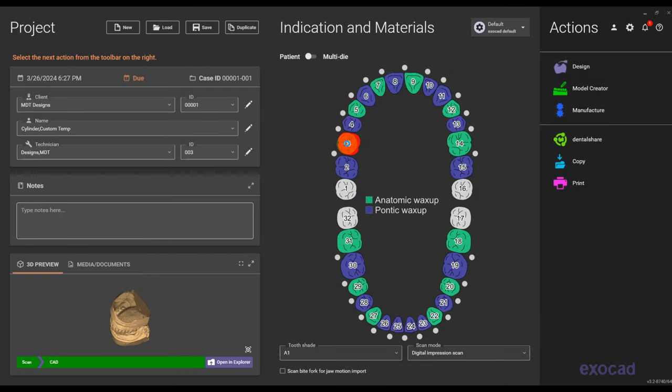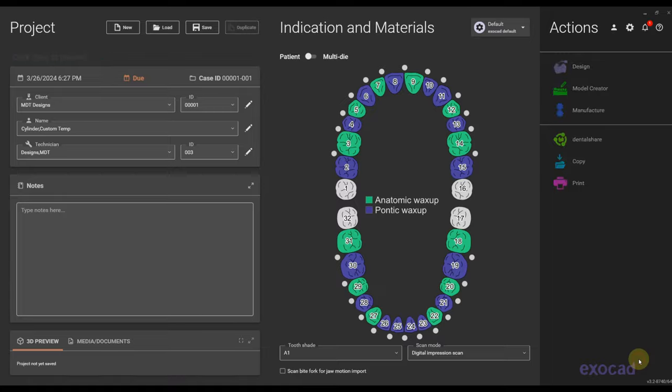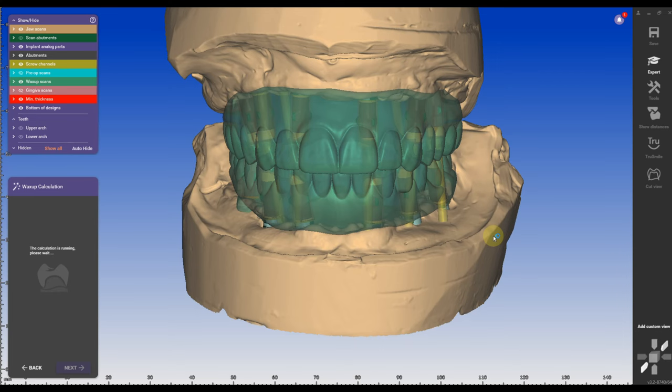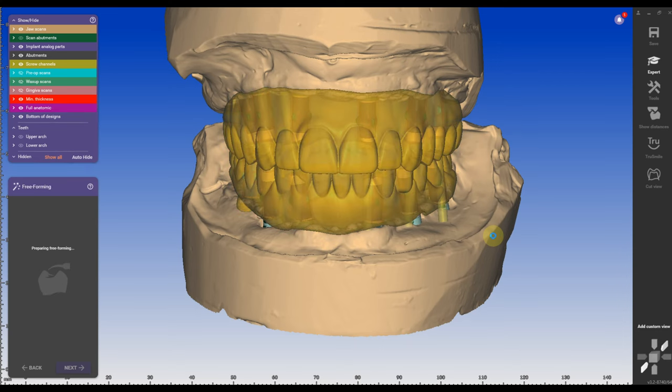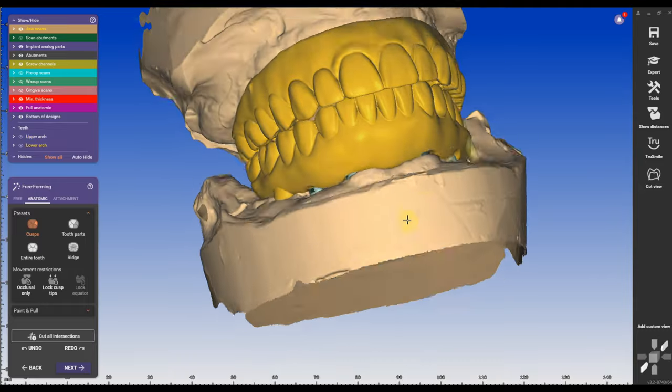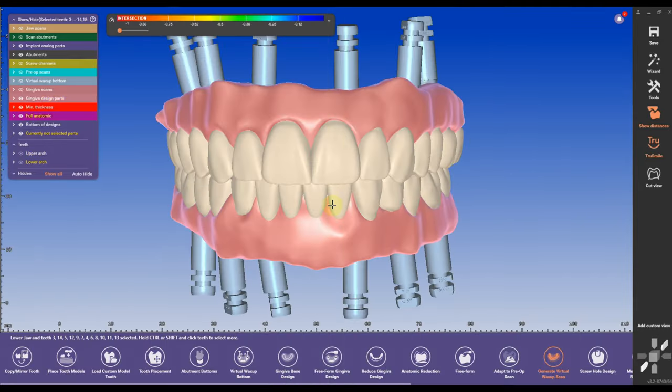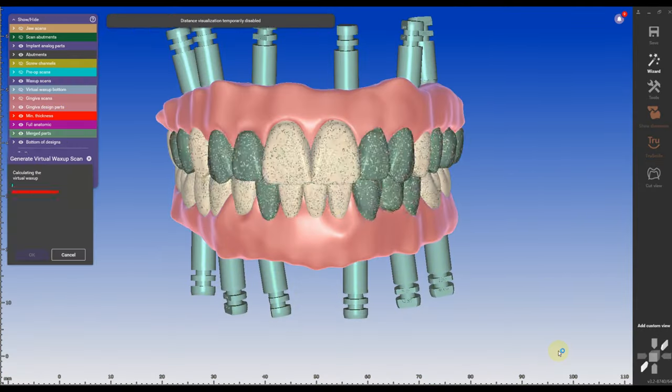If you don't want to go through this hassle with all the gingival design, just change your order form to digital wax up. You're going to scan it. Therefore, you have to have pre-approved pre-up scans that you import. Let the wax up calculation run and the free-form will adapt it really nicely to the surfaces of the arches.